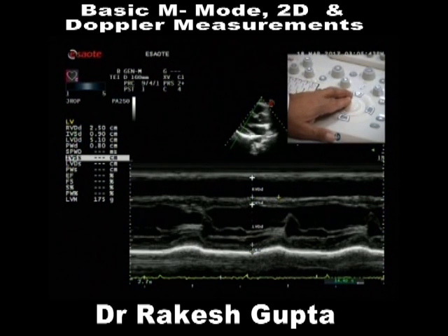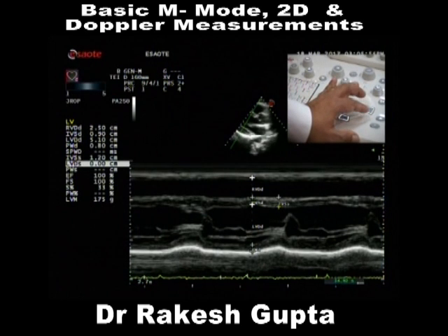Where does the systole begin? Look what it is asking: IVS during systole. So this is my IVS, same place where we did diastole, here is systole. I say enter. Now, look, IVS has become 9 to 12. Now, it is asking LV dimension during systole.